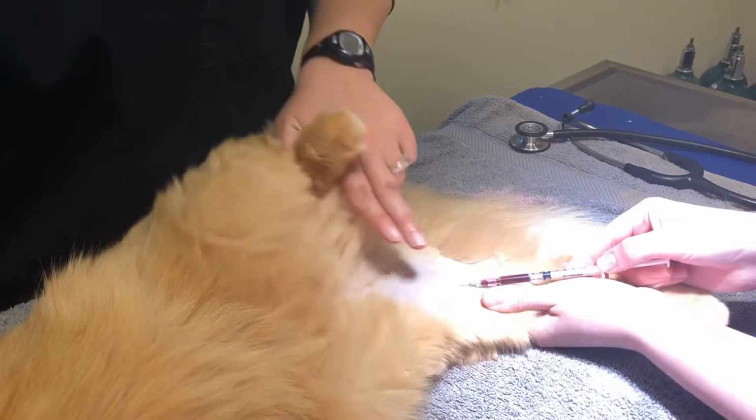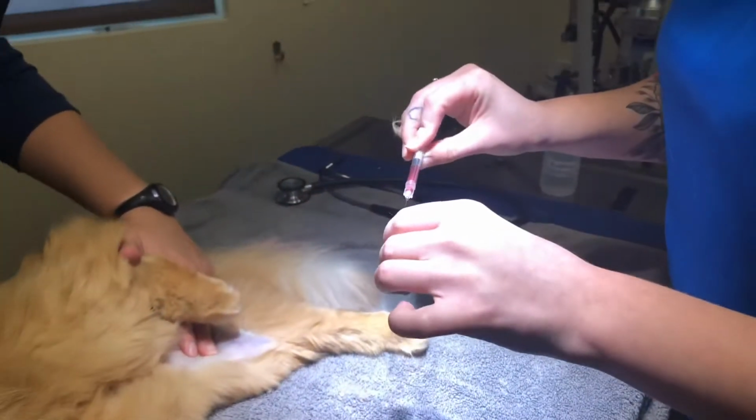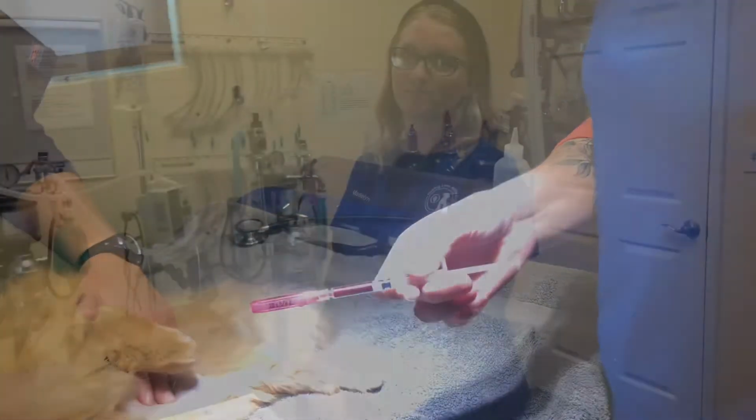Once I've obtained my blood sample, I'll have my restrainer hold off so that our patient doesn't develop a hematoma, and that's our blood sample.